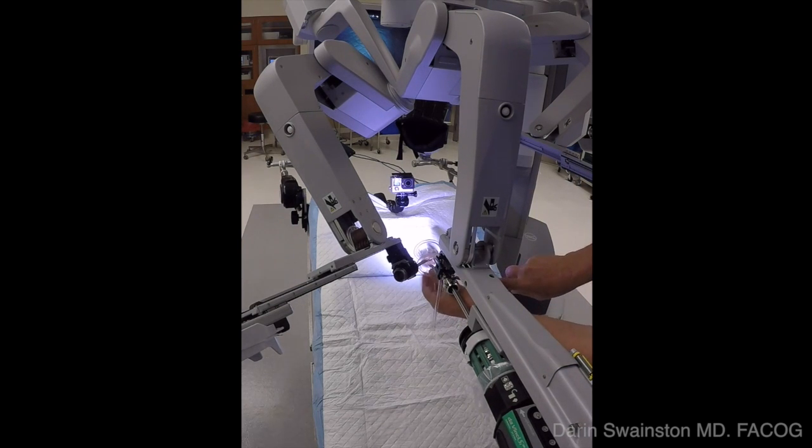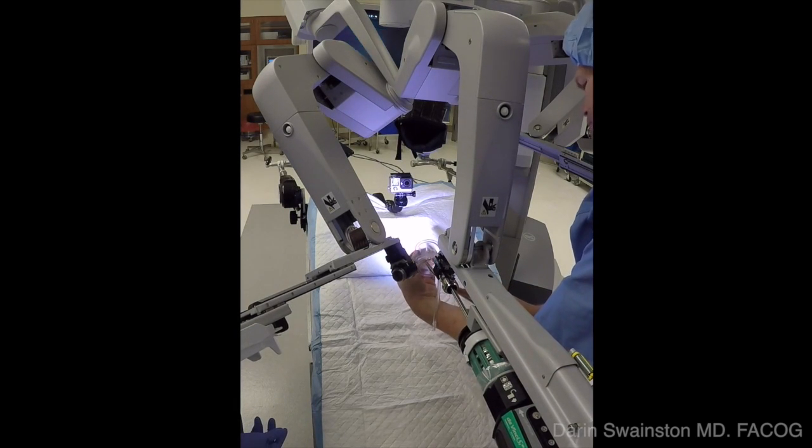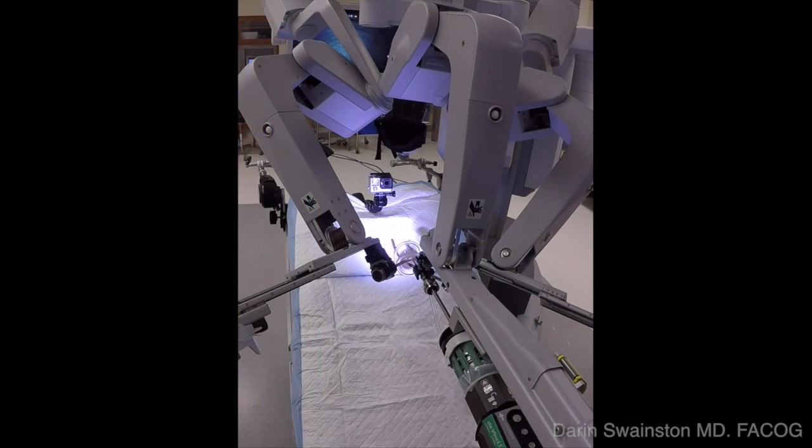Now on the left side, it's just the opposite. You will still go in, you will still pivot medially, but you will then rotate counterclockwise to bring it up into view. If you do this technique, you don't go past the V — you pivot and you rotate either clockwise or counterclockwise, and you will always see the tip immediately.